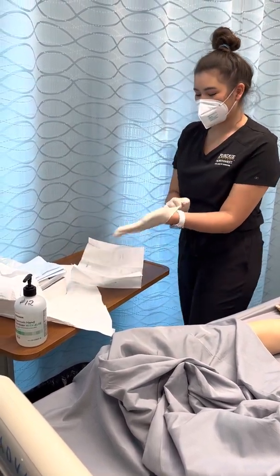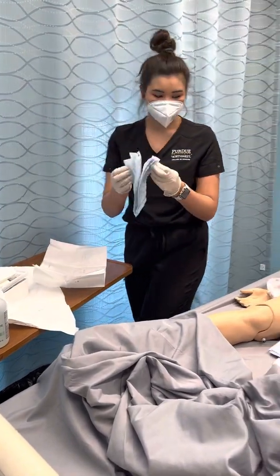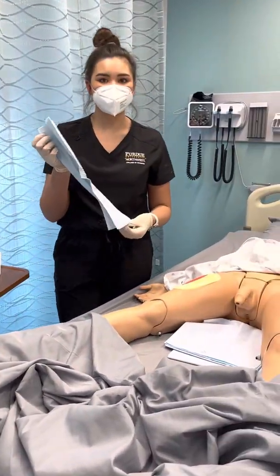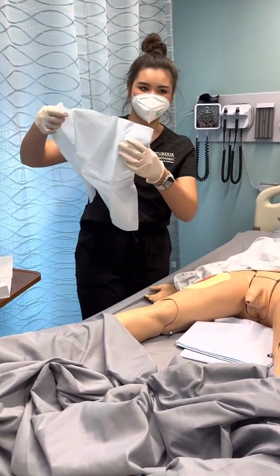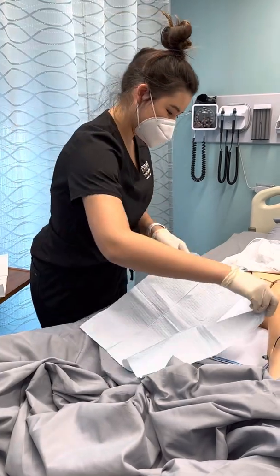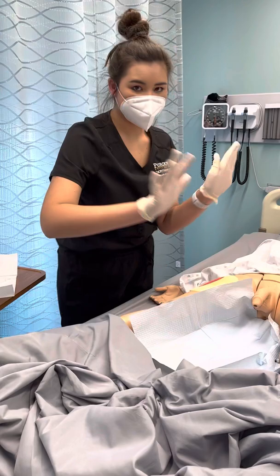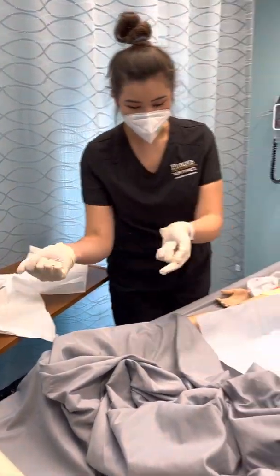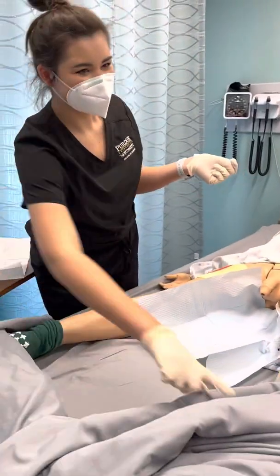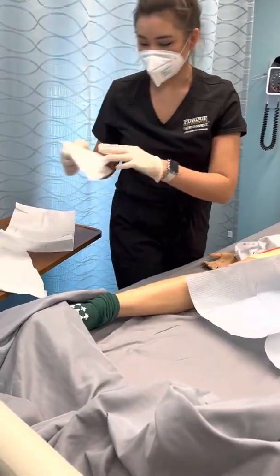I'm going to lay out my tray here. Also, my patient should be on their back and they should be slightly bending their knees — this is a dummy and they don't really do that. I don't want to contaminate my gloves or anything like that, and I should have pulled the blanket down further, so we're just going to pretend that was done already.